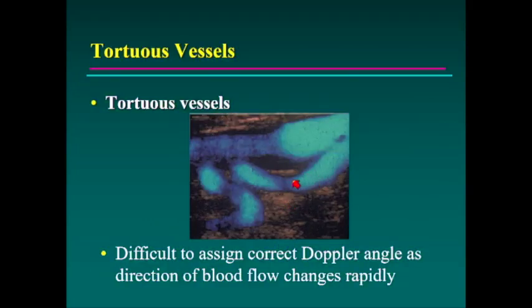And as we all know, some of the vessels are extraordinarily tortuous, as they are in this case, and it gets very hard to know how to adjust your Doppler angle in a vessel that tortuous.